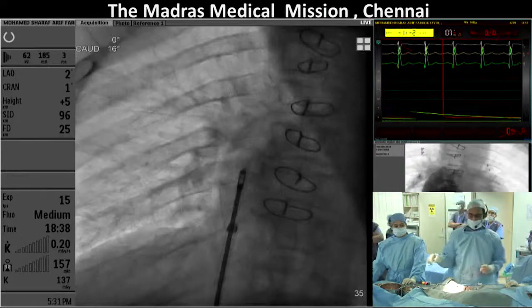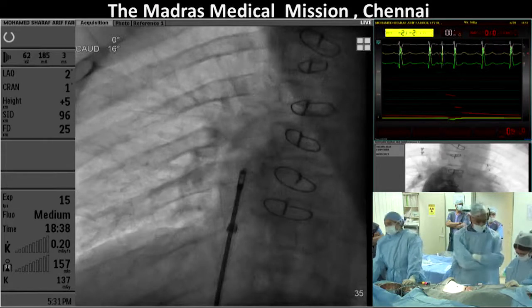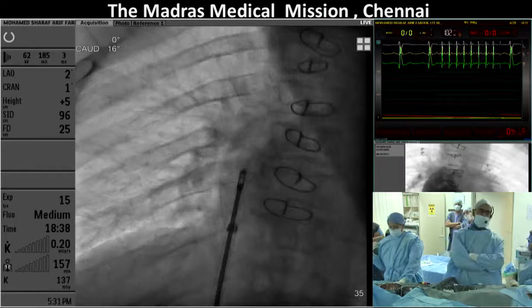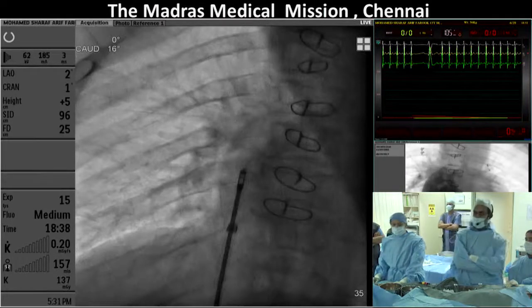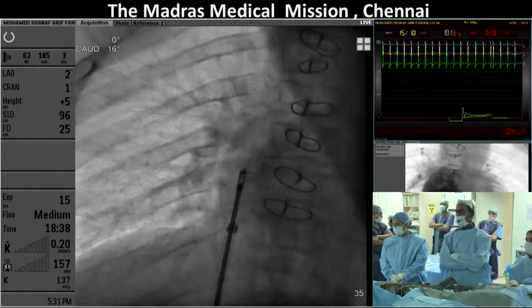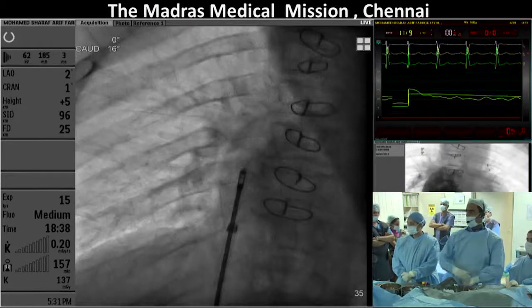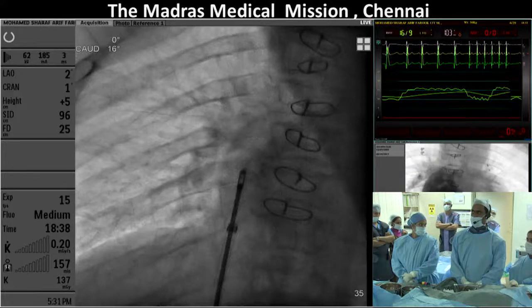Well, excuse me. When we made a complete balloon occlusion, the Fontan pressures went up to 16. But now with this fenestration on, it is currently around 13. Show it in 25 scales. So this is small speed, smaller speed. This is now a little bit of an active phase.